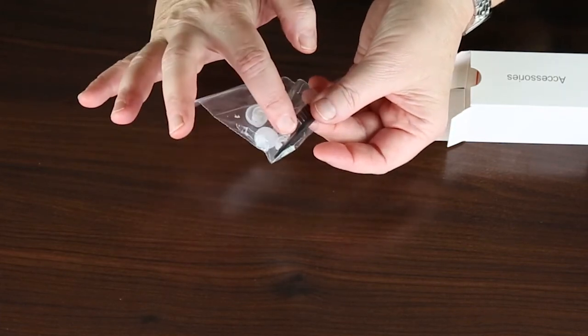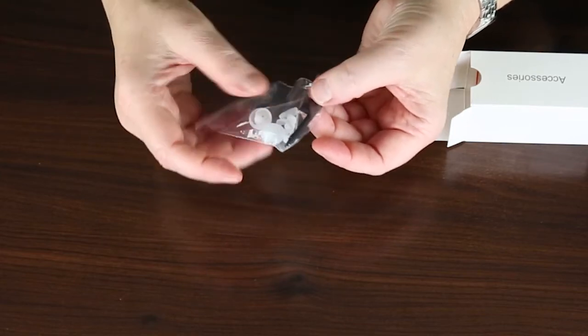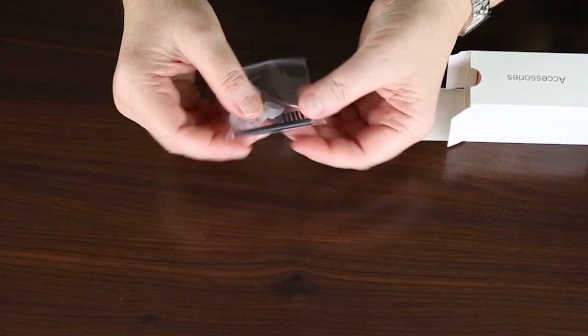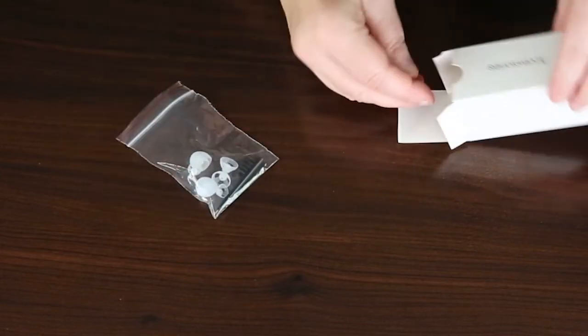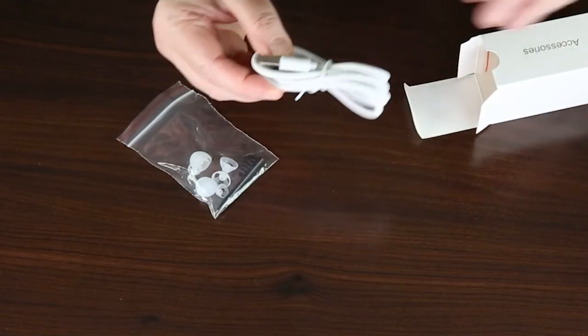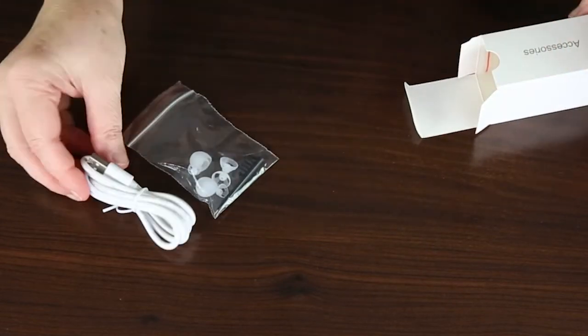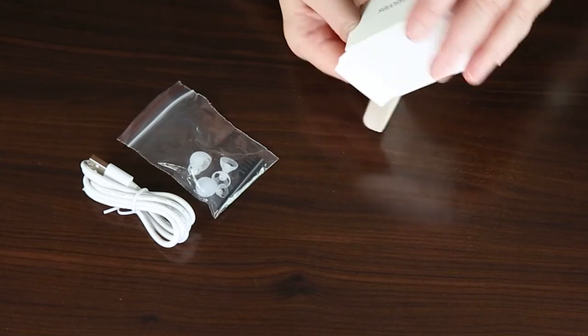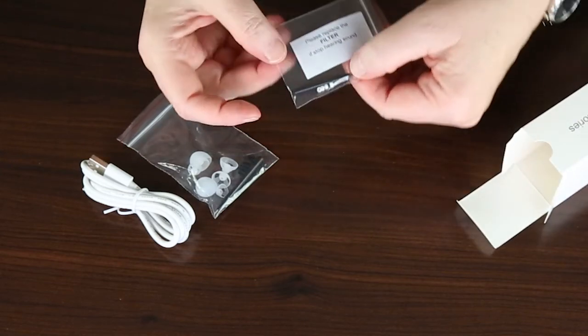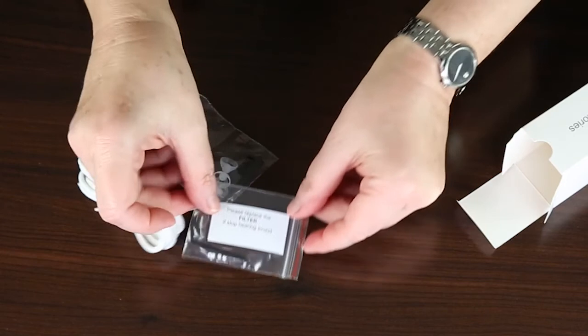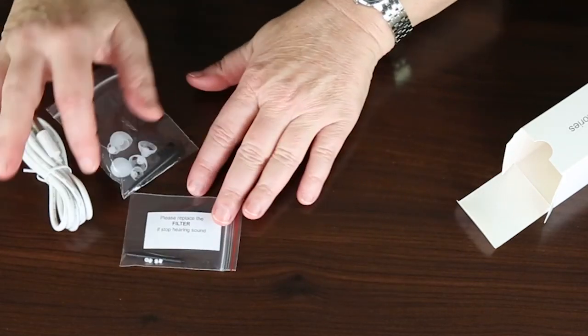Your little brush is included to keep the outside of the hearing aid clean around the dome area. You have the USB charger for your charging station, and you have your wax guards. These are the little filters. If you are not hearing sound, you will change the filter.